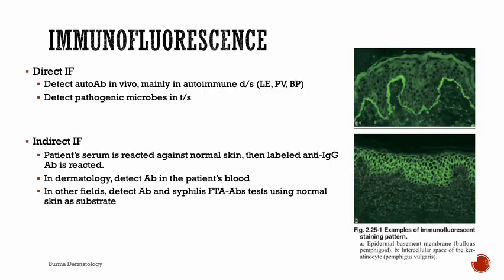Here are the immunofluorescence patterns, which can be seen in direct and indirect immunofluorescence.